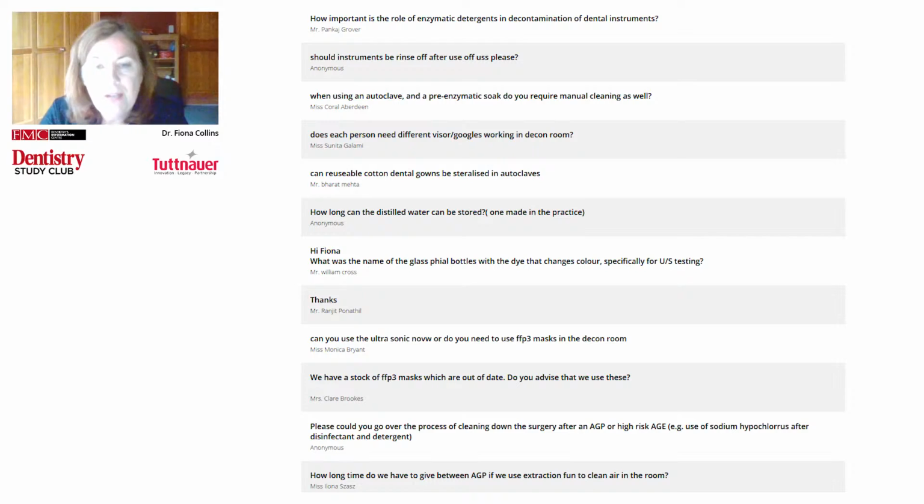Financially viable, I realise fully that they're considerably more expensive than ultrasonic cleaners. If it's not a requirement to use a washer disinfector, you certainly can use an ultrasonic cleaner. So just depending on where you're practicing. If you're in England, then I mentioned what was considered best practices, the instrument washer disinfector. If you're a new practice, it's advised to follow best practices. It doesn't state in HTM 0105 that it's mandated. So you really have to decide which way you want to go.